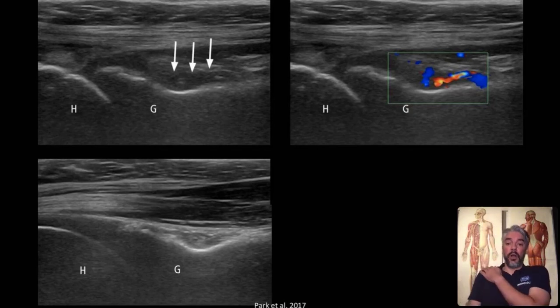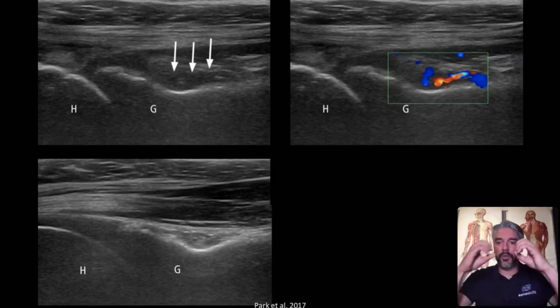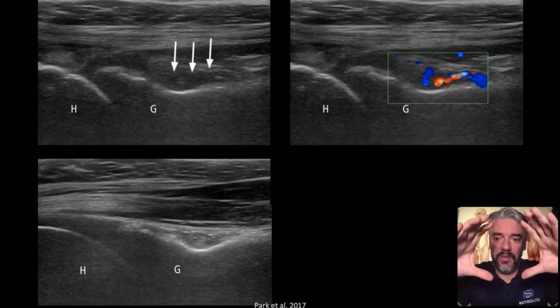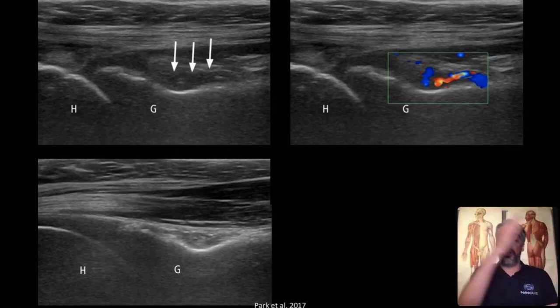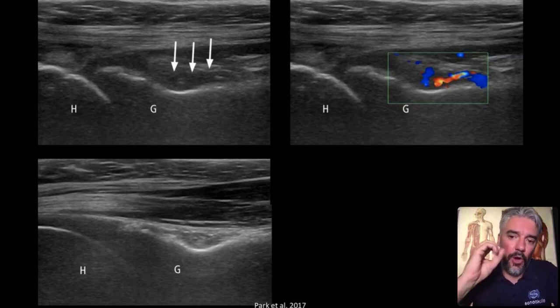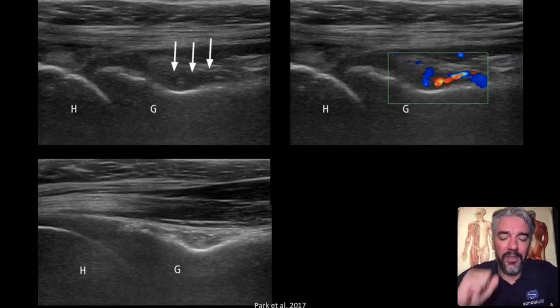And when you are making this external and internal rotation with the patient, you will see a vein becoming bigger with externally rotating, and with internally rotating becoming smaller again. And this is normal anatomy. So as long as you see this happening, this is normal.